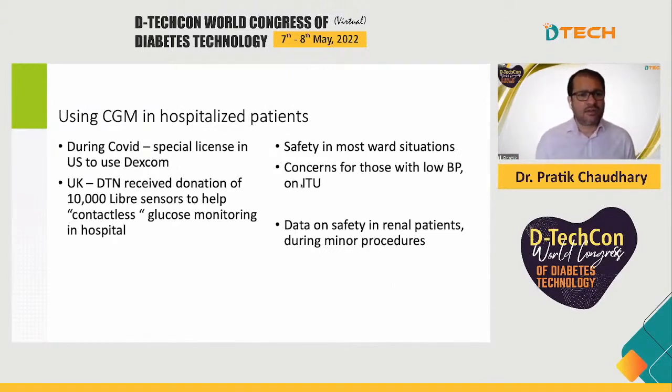So during the COVID pandemic, there was a lot of increased use of CGM in hospitalized patients. Particularly in the US, Dexcom wasn't allowed to be used, but a number of hospitals picked that up. It wasn't completely widespread, but Dexcom got special dispensation to be used for inpatient use.